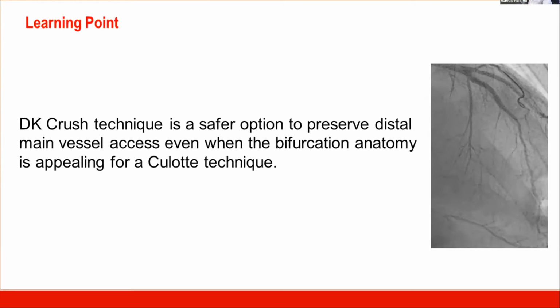I guess the question is, when Milad and his colleagues are putting the stent into the diagonal, how far back into the LAD do you put that diagonal? Oh, for the diagonal, at least 1 or 2 millimeters into the LAD, at least a minimum. That's the current teaching, at least a millimeter. You're right. So you don't want to do a swing and miss, because there's nothing worse than that. On the other hand, the classic crush was a lot of stent. And some would argue that when we did classic crush, we were always doing the mini crush.